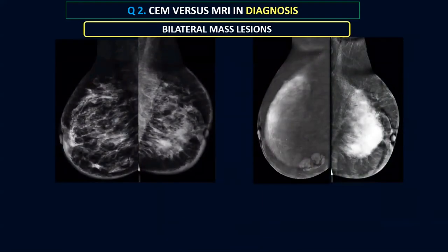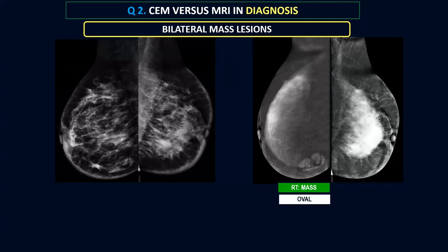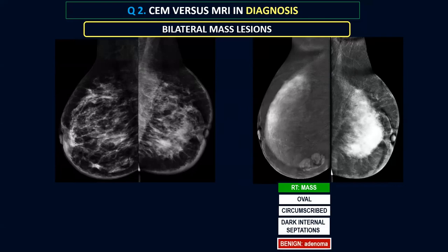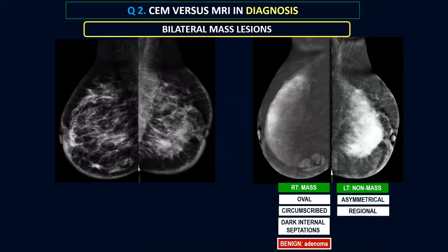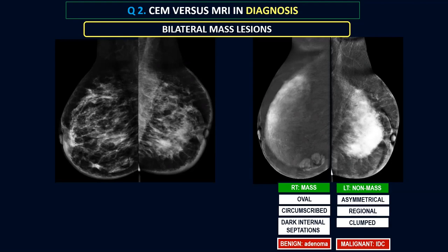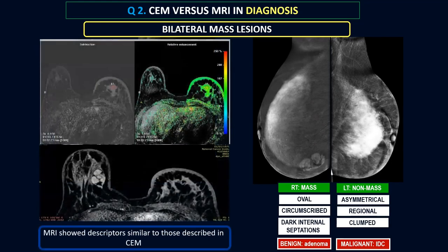Another case with bilateral mass lesions: the right-sided lesion was oval in shape with circumscribed margins and dark internal septations — all features pointing to a benign pathology, characteristic of fibroadenomas. The left-sided lesion was actually a non-mass enhancement, not a mass. It was asymmetrical — no similar enhancement in the other breast — regional in distribution, showing a clumped pattern, all features pointing to malignant pathology. This was an invasive ductal carcinoma. The MRI of the same patient used exactly the same descriptors for both lesions, confirming the agreement between contrast mammography and MRI.